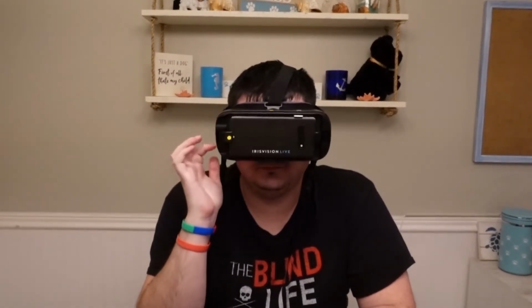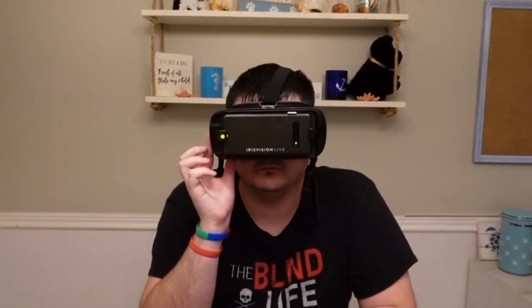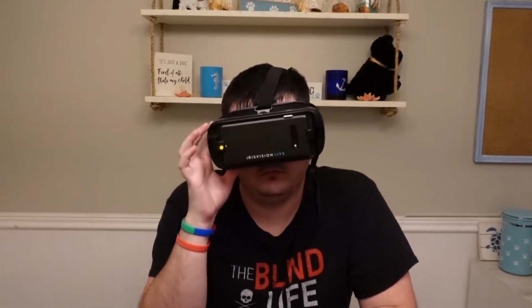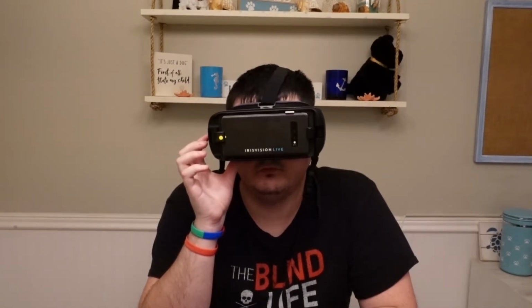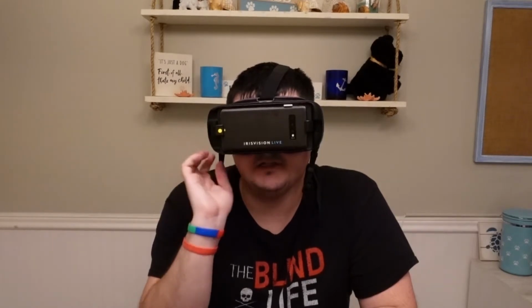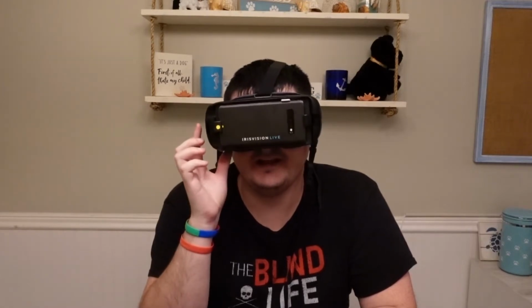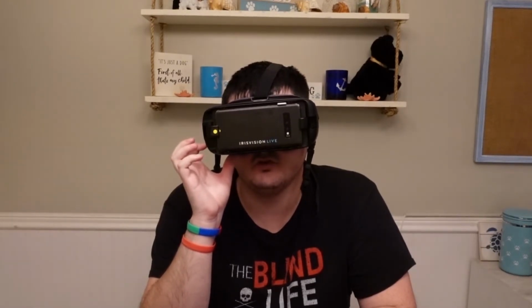So with this mode itself, if you swipe towards you on the touchpad, it rewinds the readout. Okay, cool. And if you swipe away from you on the touchpad, it fast forwards the readout. Starting online readout. Finished readout. Well, now there's nothing there. I was gonna try and do the playback and play around with the forward and the rewind and fast forward, but I accidentally took another picture. That's really cool.